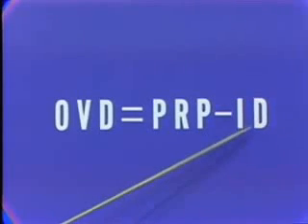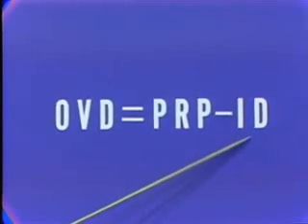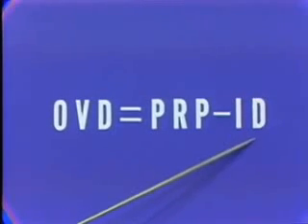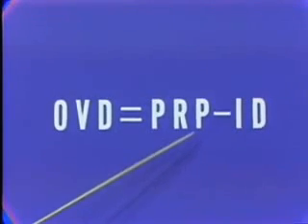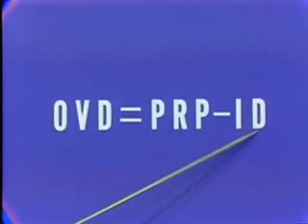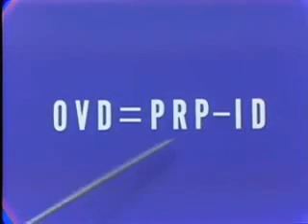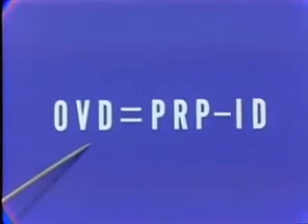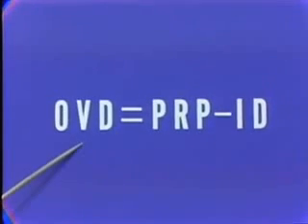Now, interocclusal distance, we can make a guess. He has to have some. We cannot encroach upon the freeway space. We have to have some. So let's give the patient 3 or 4 millimeters. So what we have to do is make a measurement here, subtract a few millimeters, and come up with the dimension of the face when the bite rims or the actual dentures are in contact. This establishes the vertical dimension of the patient's face.